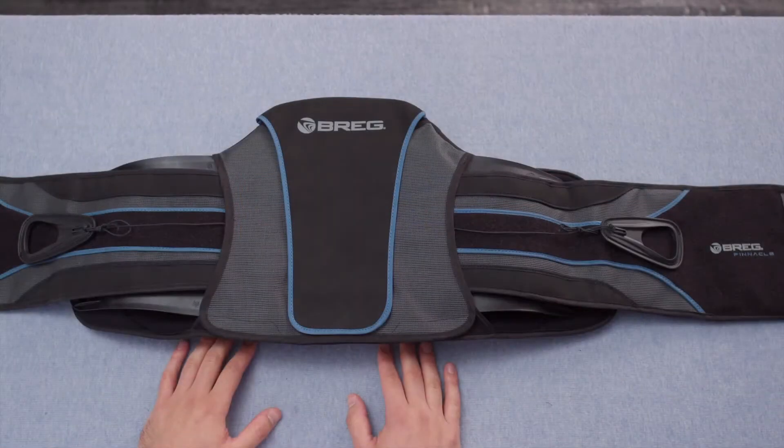It's recommended to size the waist belt in a seated position so you can lay the product flat and have easier access to the sizing components.